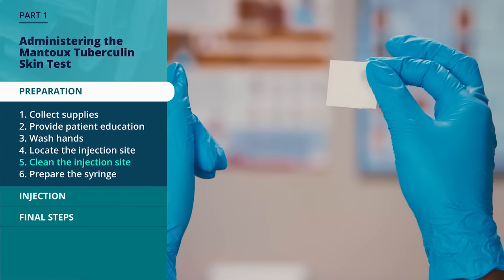The last part of the procedure is to read the Mantoux tuberculin skin test. The method demonstrated in this video is based on the palpation method. The steps include collecting supplies, inspecting the site, palpating, marking, and measuring the induration, and recording the measurement. There are several different methods for reading the Mantoux tuberculin skin test, and they can vary among facilities. For each facility, everyone reading the skin test should receive training in and use the same method. A great deal of practice is required to achieve consistently reliable measurements. The test should be read between 48 and 72 hours after the skin test has been administered. A patient who doesn't return within 72 hours will need to be rescheduled for another skin test.